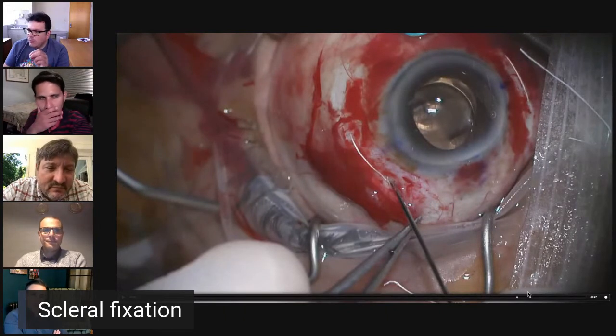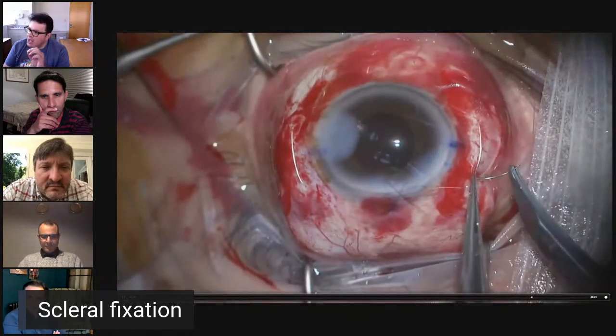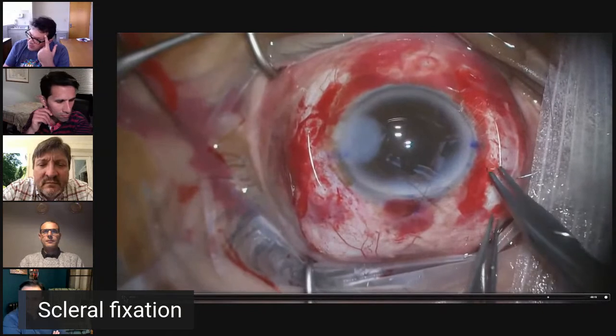Yeah, and then I hold from the knot or from the tails now, and I try not to manipulate the suture itself, and I dunk it in. And here, I try to avoid that now as much as I can. And then if I think that the port is big, I would suture it because of hypotony. This is a common issue.